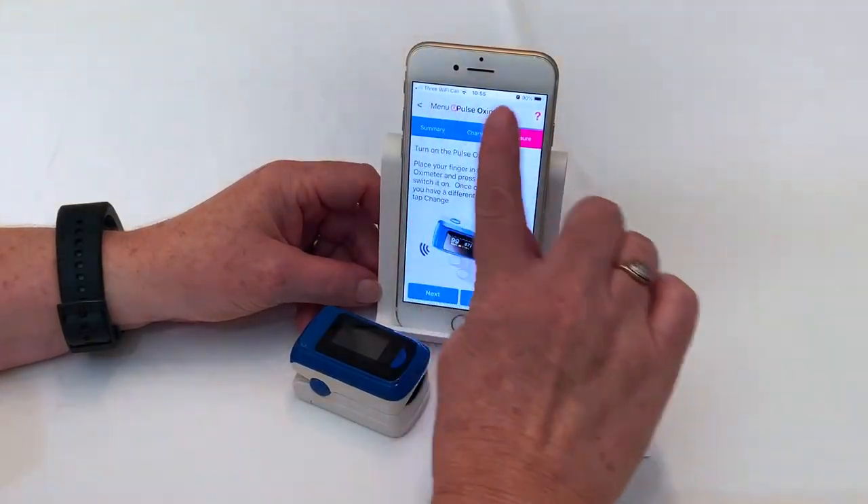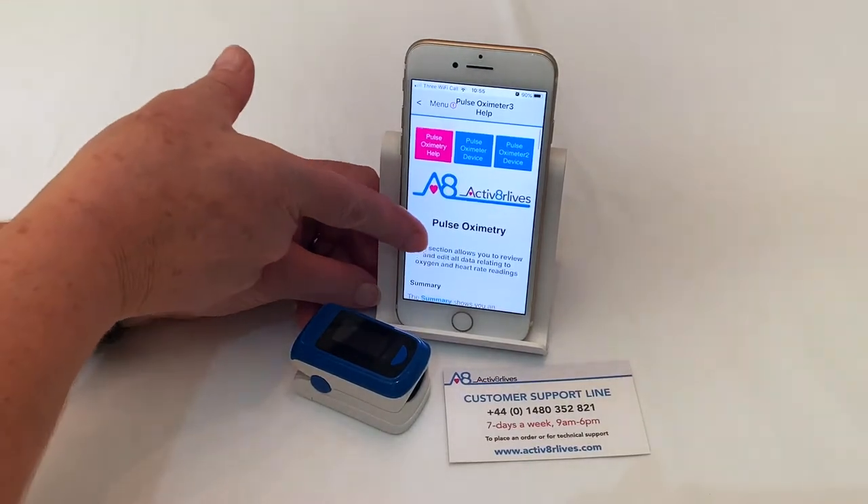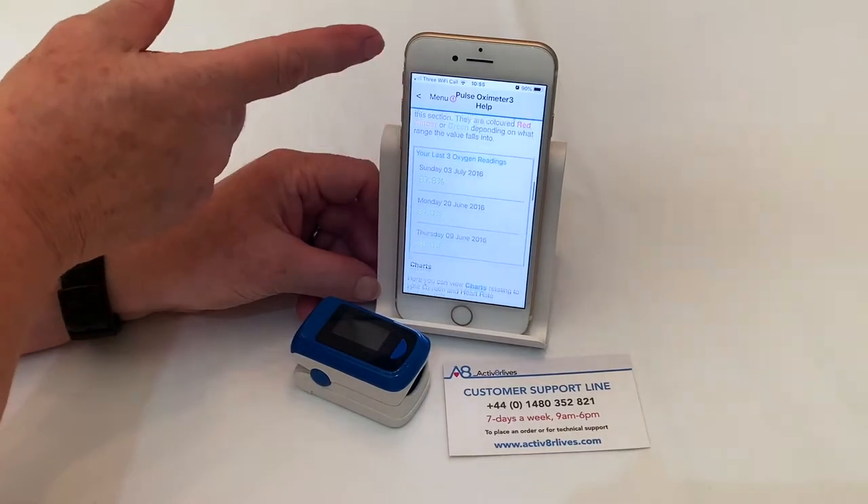For help on any page, you will see in the top right-hand corner a pink question mark, which will take you to help information. Scroll down through this for helpful information and videos.